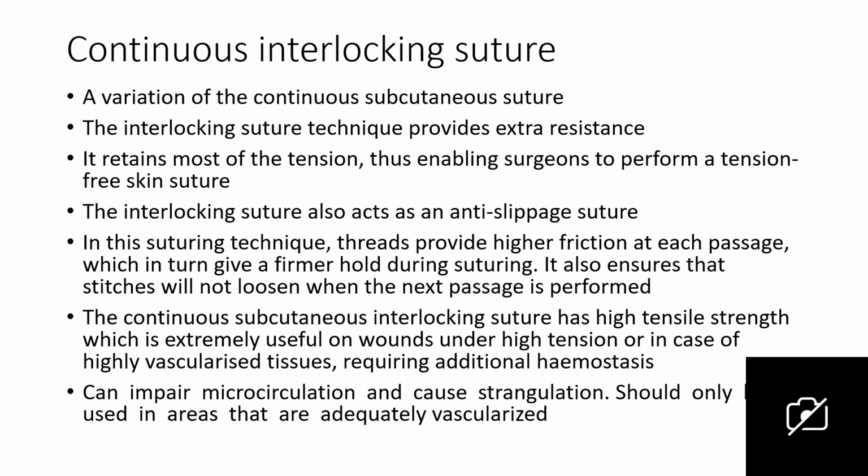Continuous interlocking suture, a variation of the continuous subcutaneous suture. The interlocking suture technique provides extra resistance. It retains most of the tension, thus enabling surgeons to perform a tension-free skin suture. The interlocking suture also acts as an anti-slippage suture.